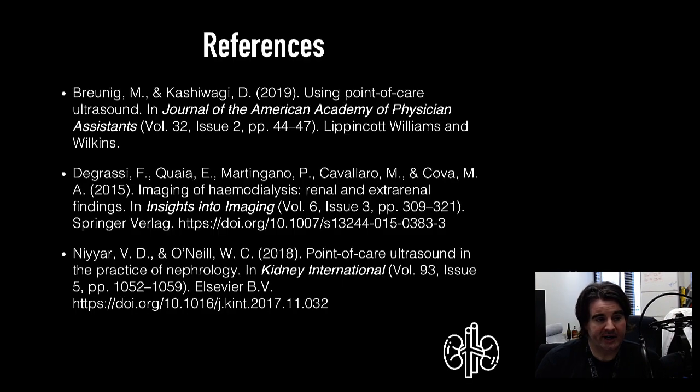Well, that's it for now, folks. I hope we provided a solid review of examining the kidneys for obstructive renal disease and provided you with a good framework for assessment of severity of hydronephrosis.